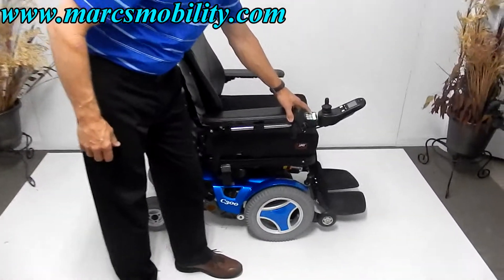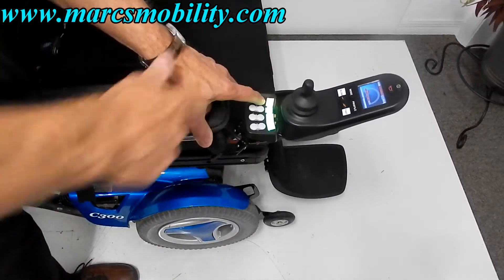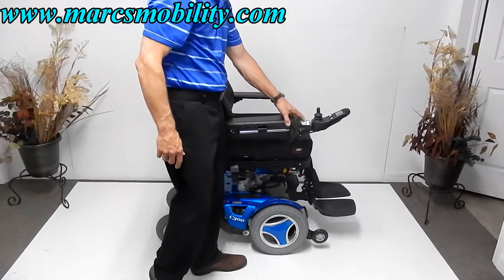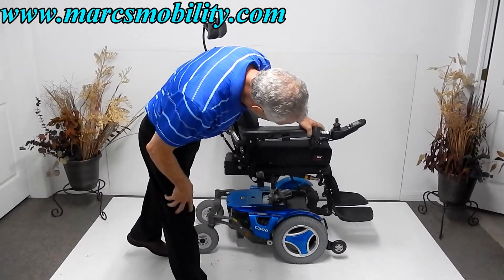The first thing I'm going to show you is the electric seat lift. The features are labeled on the box — tilt, recline, legs, height. So this is your 8-inch seat lift in action.